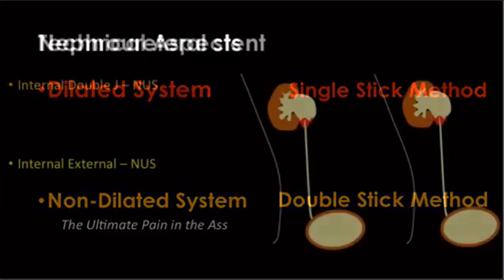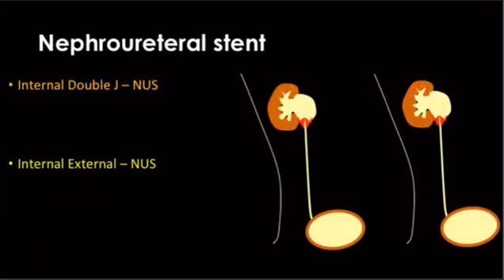And then everything is the same after that. So nephroureteral stents are sort of the ideal endpoint for somebody that's requiring more permanent placement of a nephrostomy tube. Why, might you say? Well, I should back up, and I should say, there are external nephroureteral stents, which is basically a situation where you've got a blockage like here, and then you place your nephrostomy tube with a stent all the way down into the bladder, and then you've got a bag hanging outside of the patient, and that sucks. Terrible quality of life.